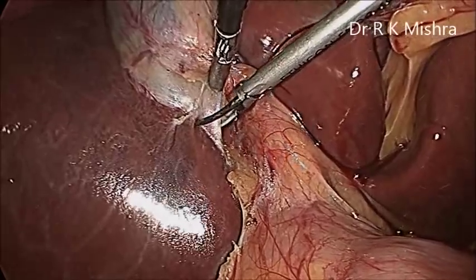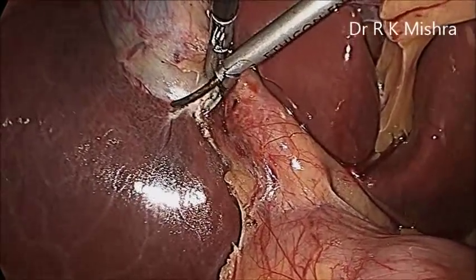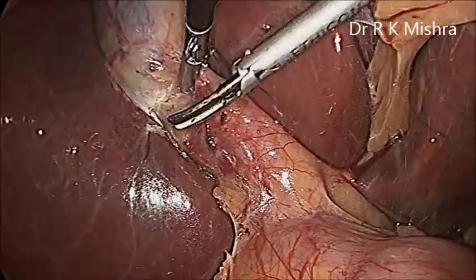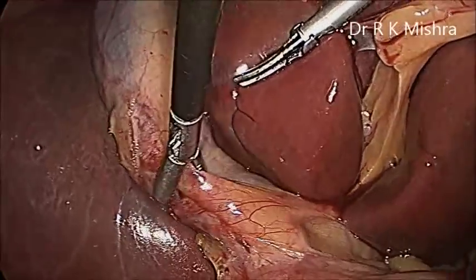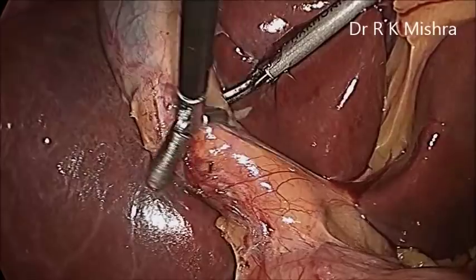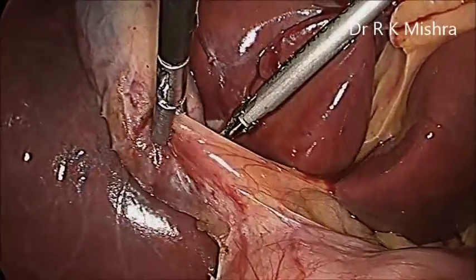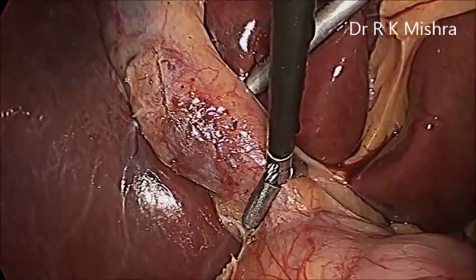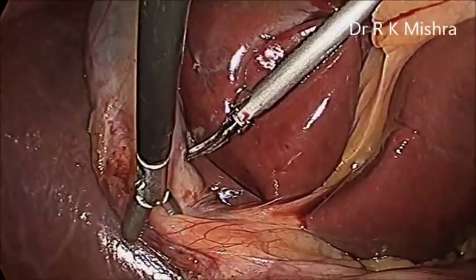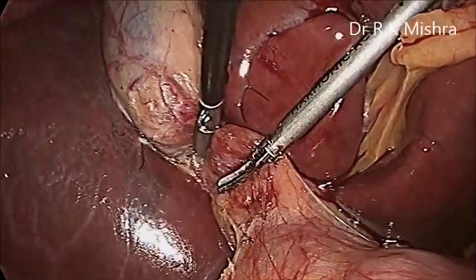Here the peritoneum is a little bit dissected towards the gallbladder. This is a good practice. Again the same thing will be done in the anterior aspect. You can give a little anterolateral traction. This is just to feel the stone.